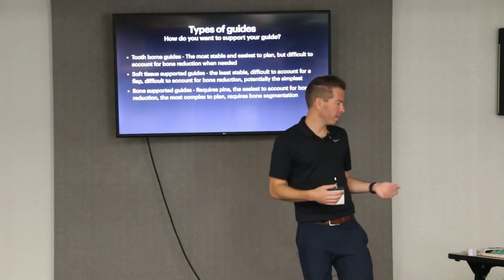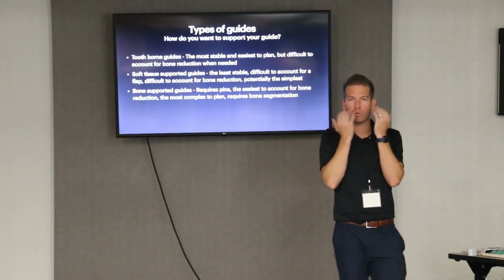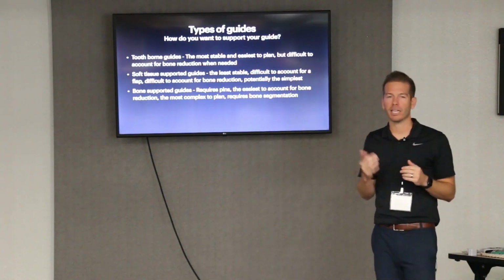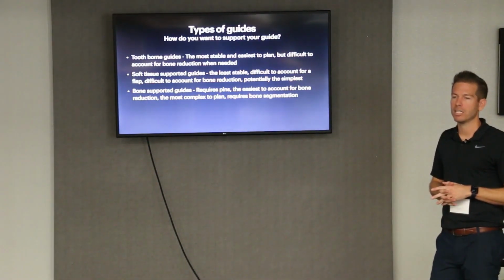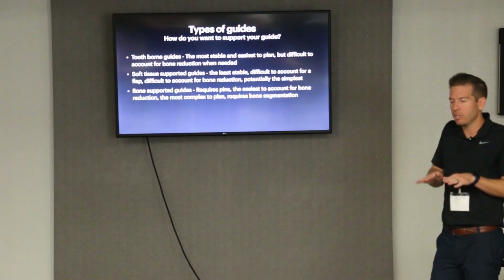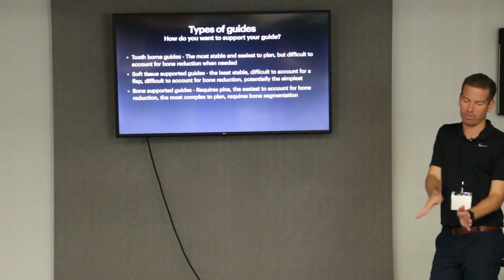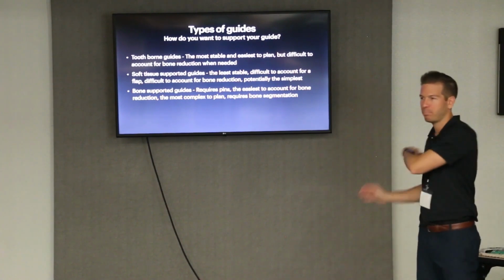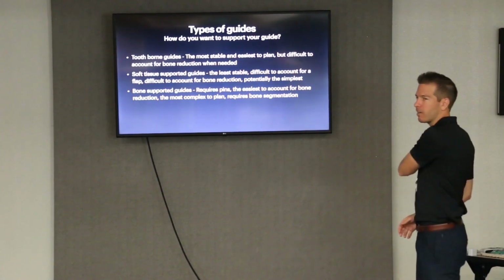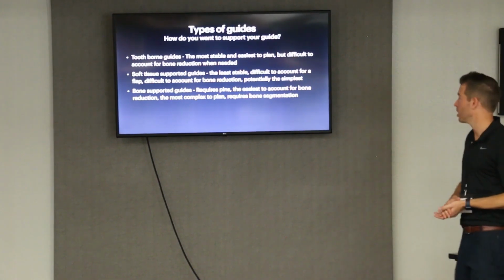So Latoya's is more in that 12 to 15, 12 in the back, 15 more in the front, and you'll see that in her case, and it's great, it's fine. Her case just didn't need that much bone reduction. You can then do just more like a minimal flap after you've placed your implants. You just tease it back and say, okay, that bone's too high, and just take it down instead of a big old crazy case where you're hacking everything. You can be a little bit more conservative, which is nice.